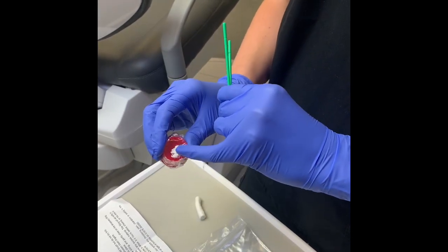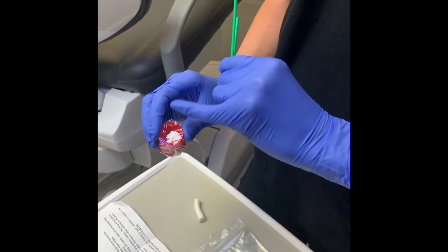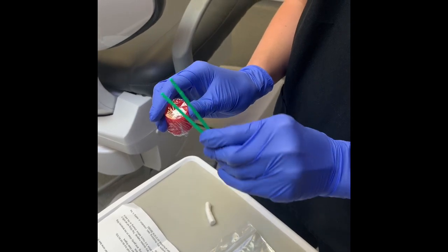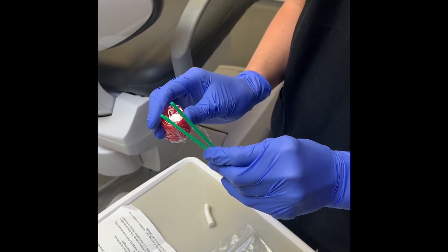Roll up a little bit of the material with your finger, place it on a nice dry tooth with lots of light, and then use the back of the brush to pad it in place and make sure it's secure.